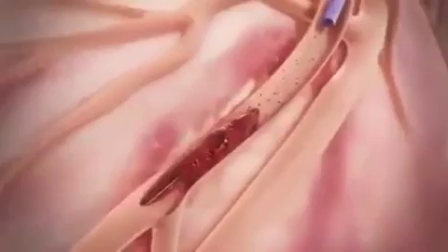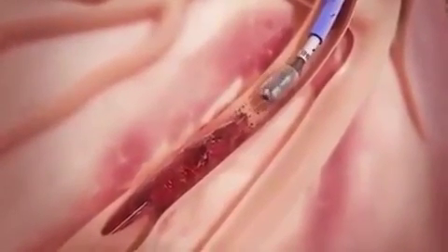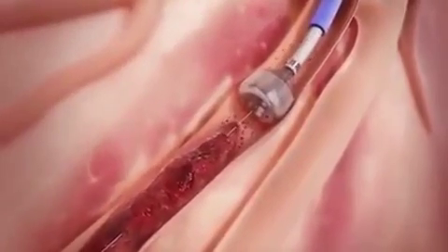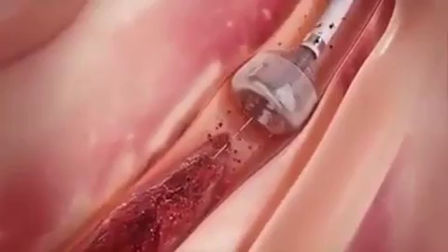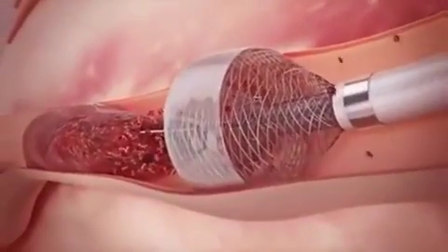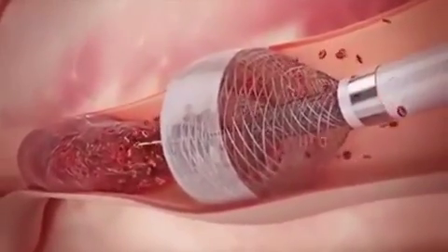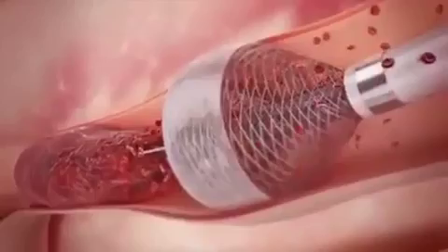The catheter is first positioned just proximal to the clot. The funnel mouth at the tip of the catheter is then deployed, occluding blood flow with its silicone elastomer on the distal aspect of the funnel. This results in the mouth of the funnel tip being maximally expanded in a radial fashion by the patient's own blood pressure, creating a seal against the arterial wall and arresting blood flow.